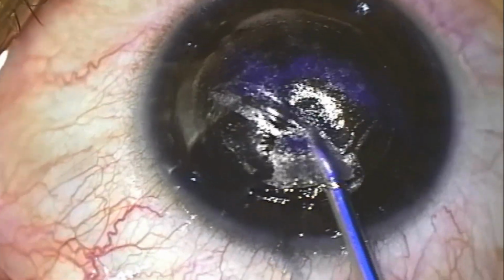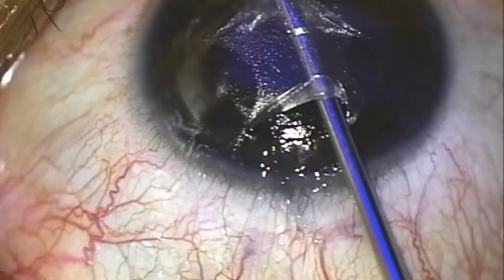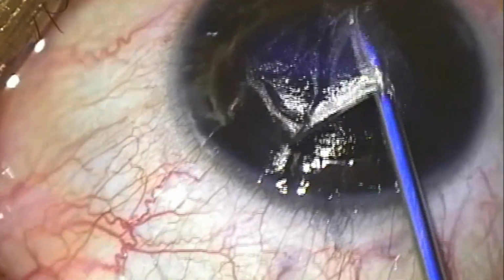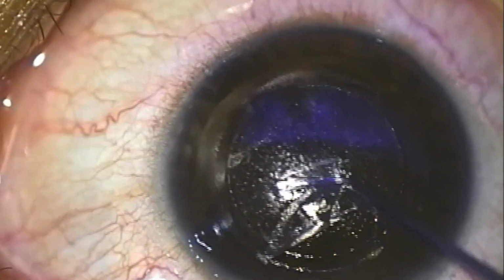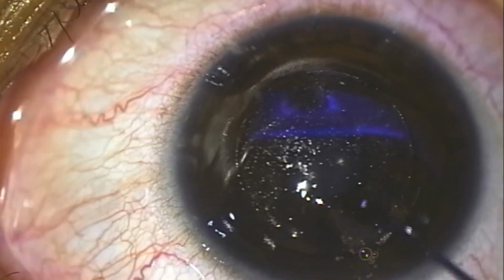If we take a look at this particular case, there is a marked resistance in the separation of the lenticule, which leads to a tear of the hinge in the tunnel incision. This resulted due to improper dissection followed by a tugging movement to retrieve the lenticule. Such complications are not uncommon.